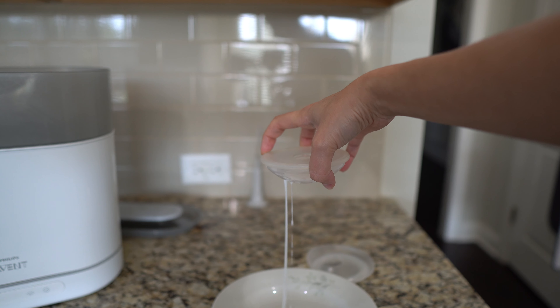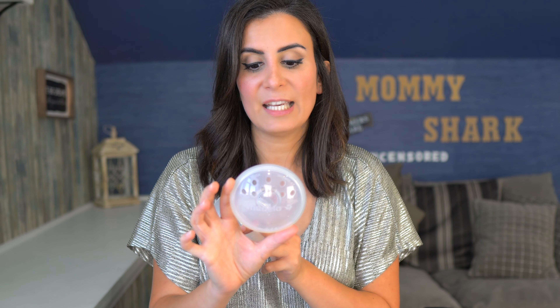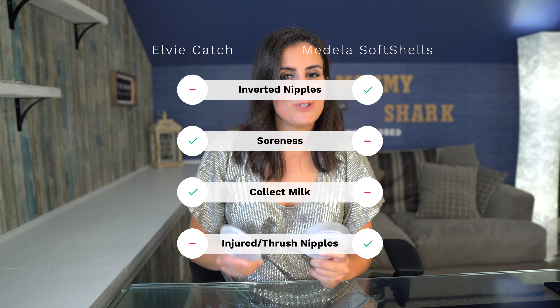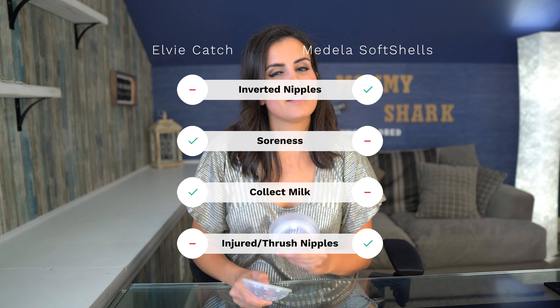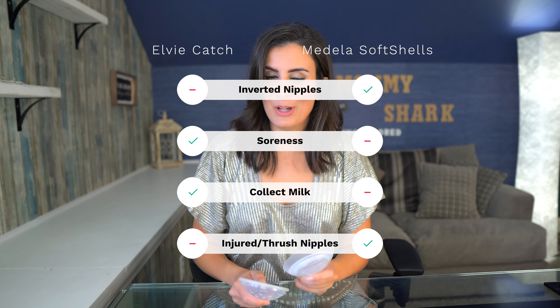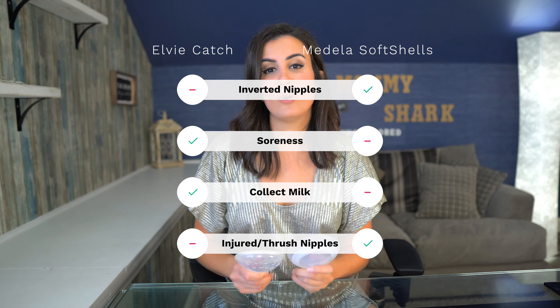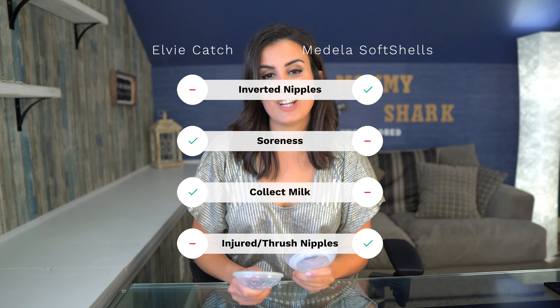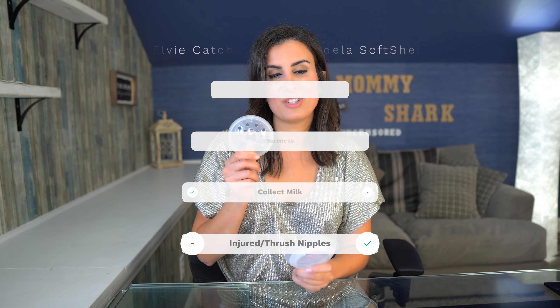The Medela Soft Shells actually come with a foam that you can put at the bottom to soak up the milk so you don't have leakage. So to summarize: if you have inverted nipples, go with the Medela Soft Shell; if you have soreness, go with the Elvie Catch; if you want to catch milk, go with the Elvie Catch; and if you have thrush or wounded or injured nipples, go with the Medela Soft Shell for the breathability aspect.